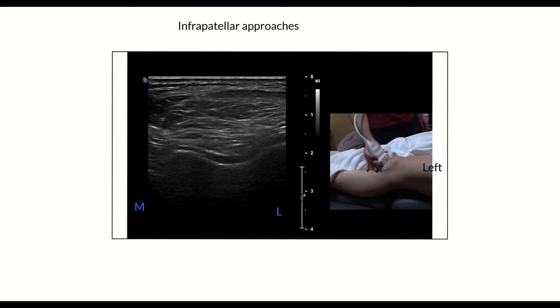Next, let's talk about infrapatellar approaches. I'm doing this more and more in my clinical practice — it seems that with the knee extended, an infrapatellar approach gives you really simple sono anatomy to look at and you're not chasing fluid. In this example we're scanning a left leg, with my thumb on the medial aspect of the ultrasound image, labeled M for medial and L for lateral, corresponding to the medial and lateral femoral condyles.